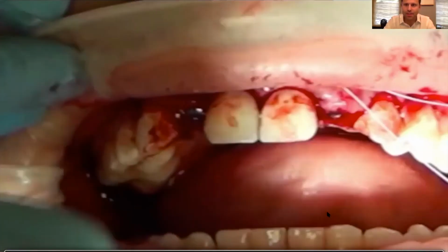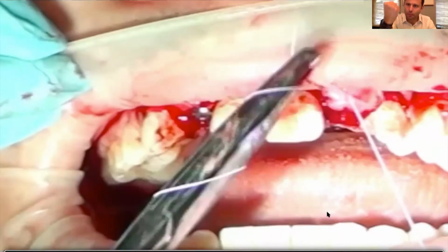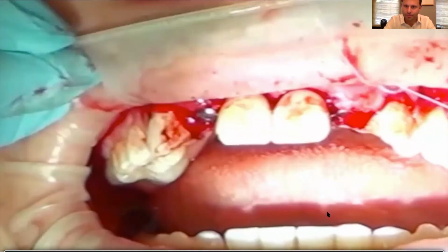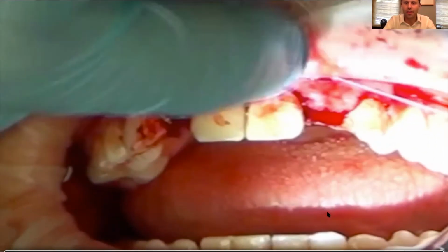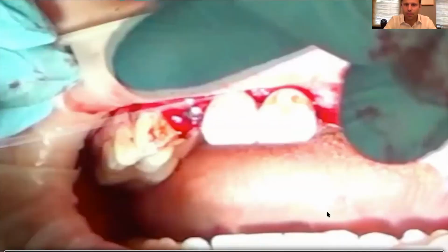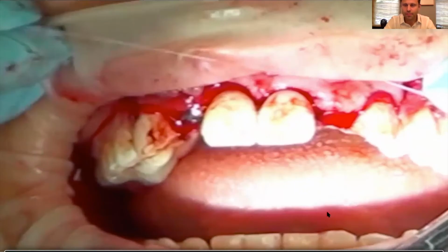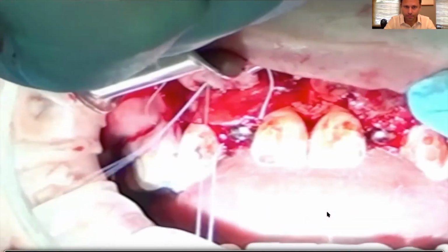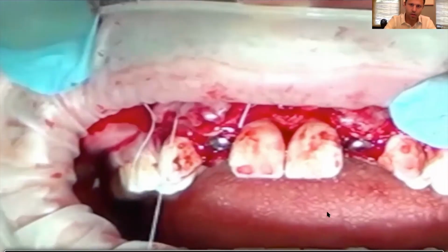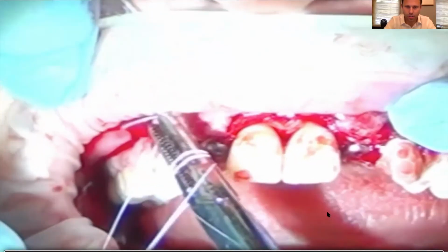But it's not because there's tension on the tissue, but because you're so deep up into the vestibule that you're pulling all of that area down. And we'll show you as I do the other side, when you start moving around the tissue, that there isn't any movement of the free tissue at the lip that will later be sutured with another material. So you see the same thing happens on the opposite side. Go really deep and bring that tissue down with the suture.